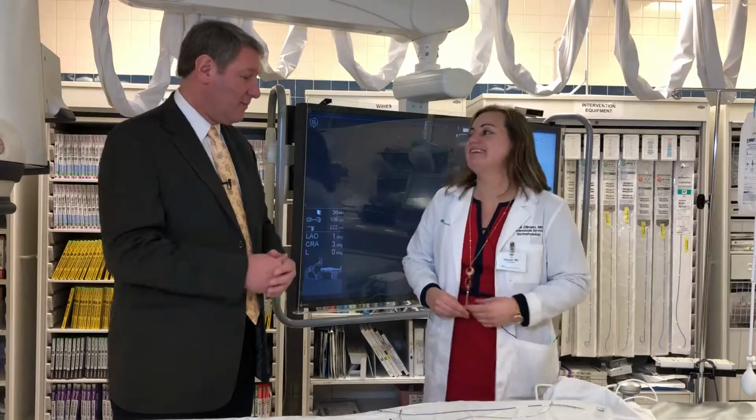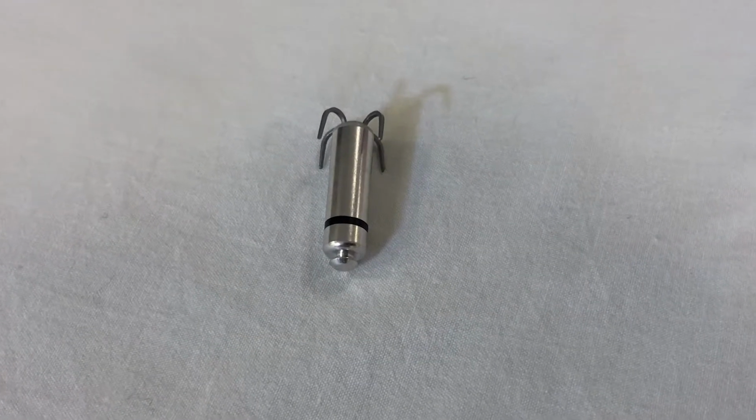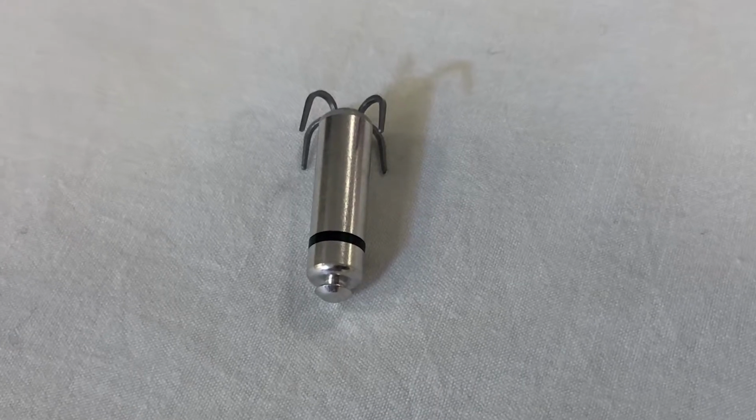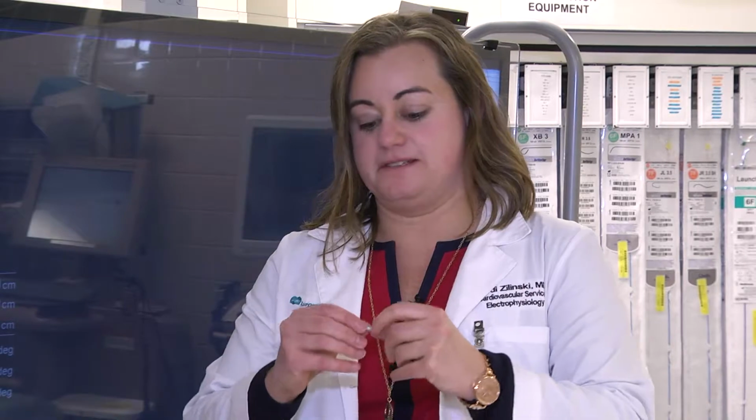Right, and these devices have been around for a while. Technology is also improving and making devices smaller and giving you a little more freedom. Exactly. In comparison to the traditional pacemaker, which is put in through a vein in the heart and sits up in the collarbone, now there's newer pacemakers that are basically the size of a bullet. Looks like a fish hook. Or a fish hook that gets put in through the vein in the leg. As with everything else in today's modern technology, we're going wireless. So this is sort of a wireless or a leadless pacemaker.